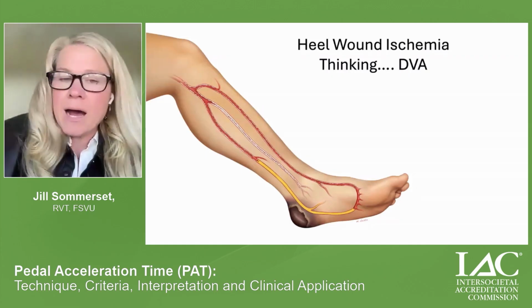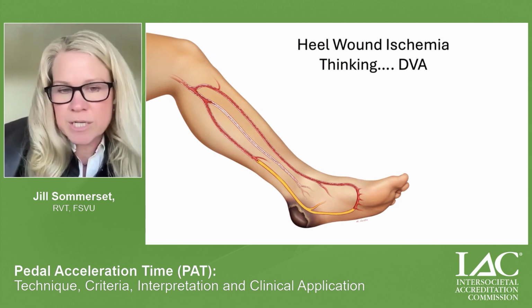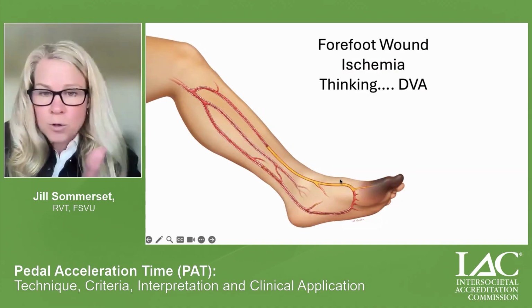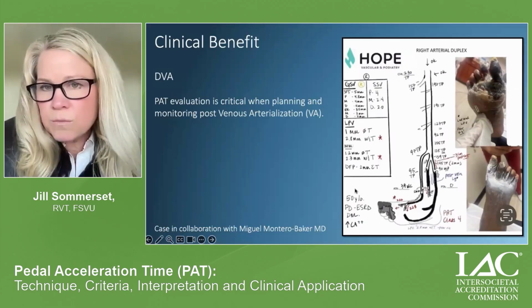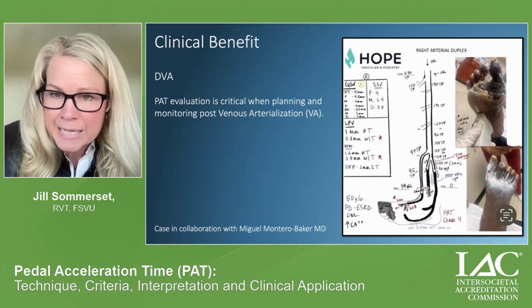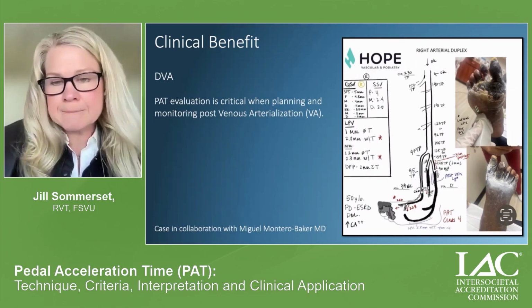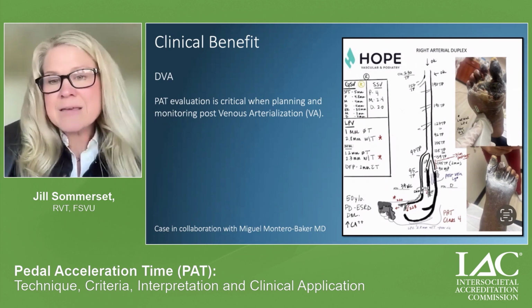I'm thinking about how we are going to increase arterialized oxygenated flow to the wound bed. And regardless of where the wound is, these heel wounds can be very challenging. Forefoot ischemia can be very challenging. So there is a role for using PAT and pedal duplex in the mapping for pre-DVA patients.